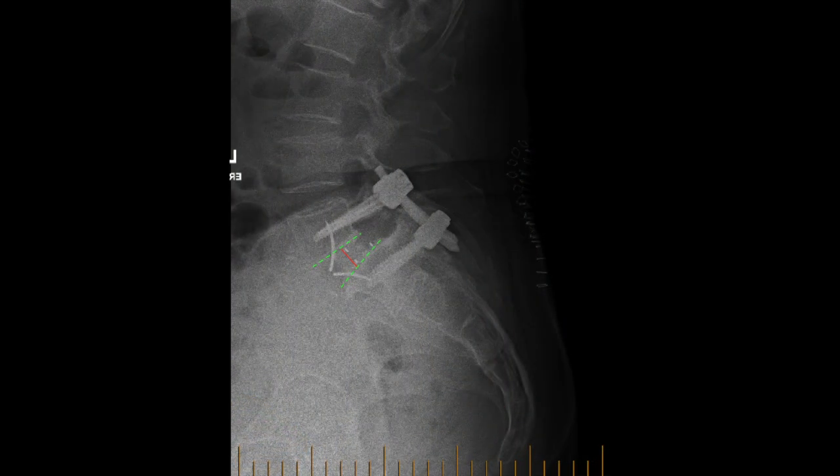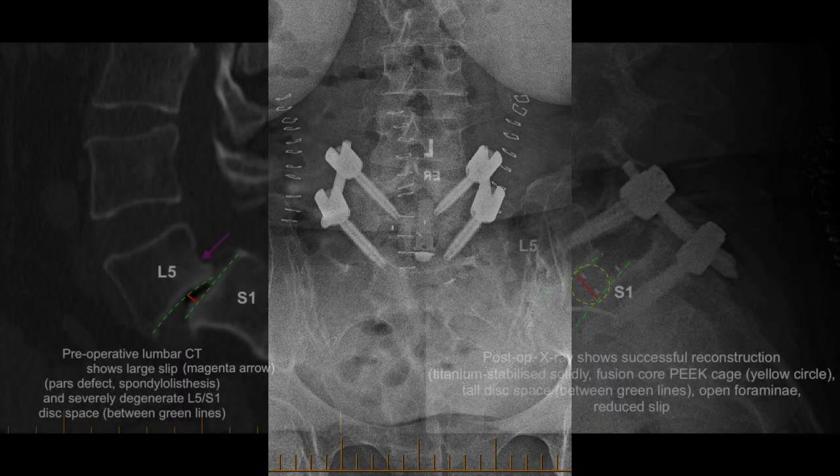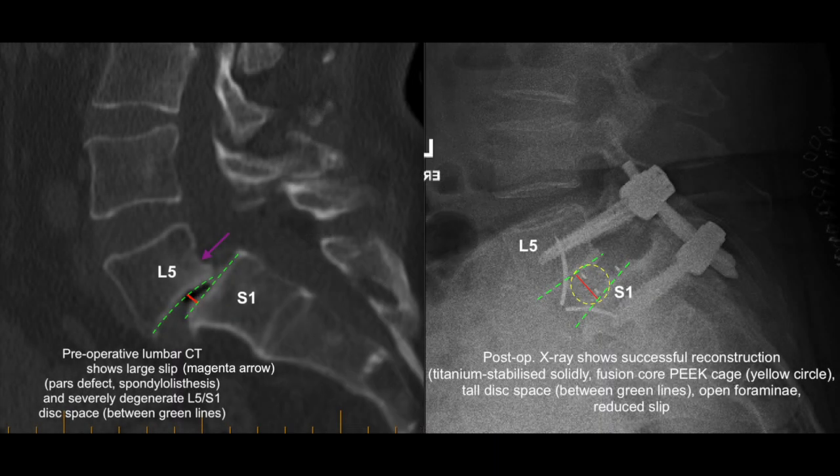You can see here the final images laterally and via anterior-posterior projections showing very sound reconstruction. Look at the left preoperative and compare it with the right — she has a lovely big disc space, open windows for the nerves, and all solidly fixated. She's done so well.